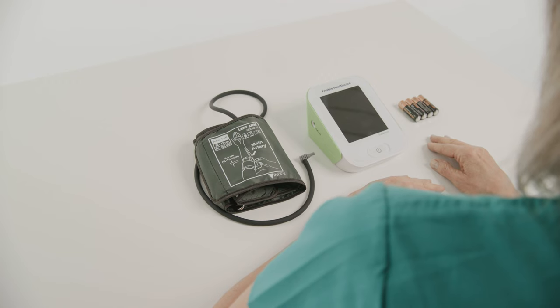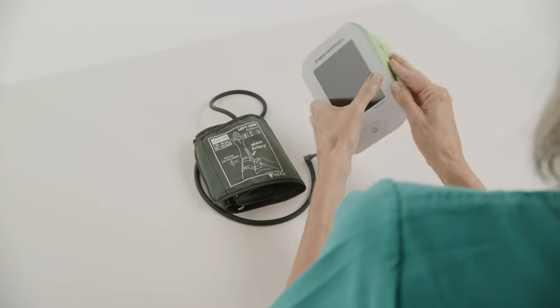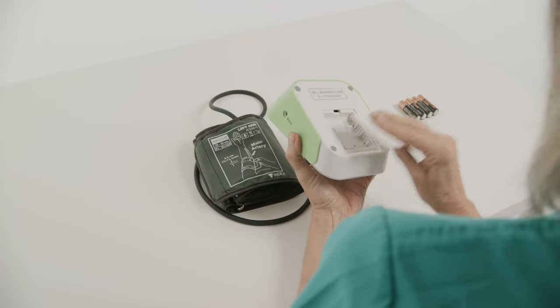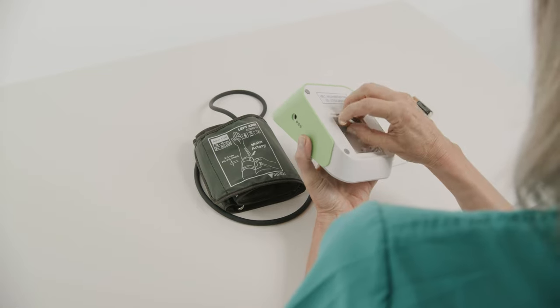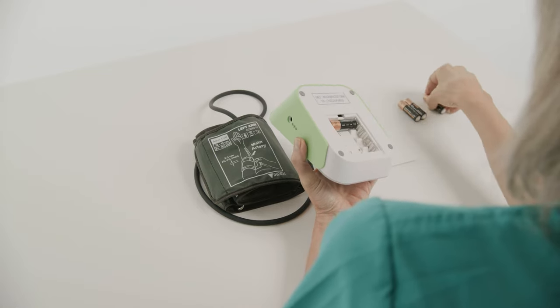When you first receive your device, you'll need to remove the blood pressure device from the box and place the provided four AA batteries into the compartment on the back of the device if it isn't already done so.